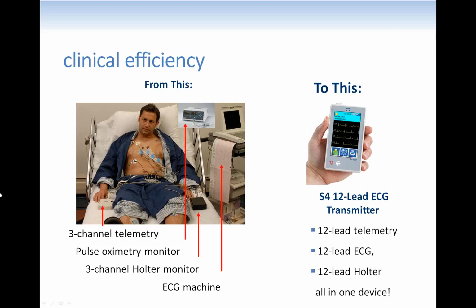The requirement that you might have for an electrocardiograph, Holter, and a 12-lead or a reduced lead set telemetry transmitter are gone, and you have the subjects walking around and acquiring this continuous data like you would with a Holter recorder, and you need to have them only lying down in the bed when they need to be, when there would be a time point coming up, and it reduces the burden on not only the subject but on the staff as well.